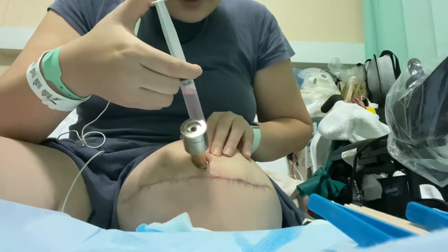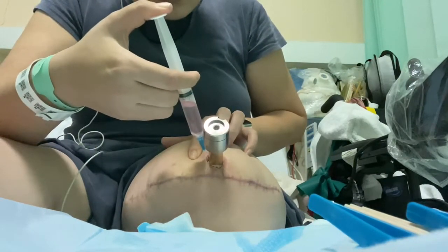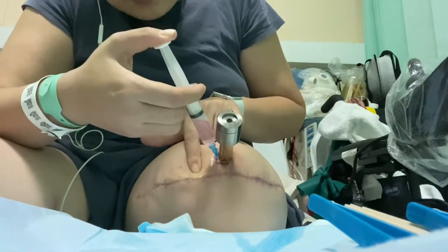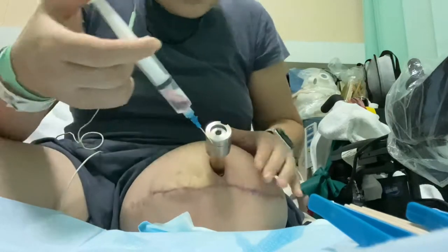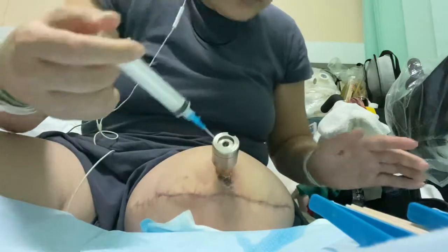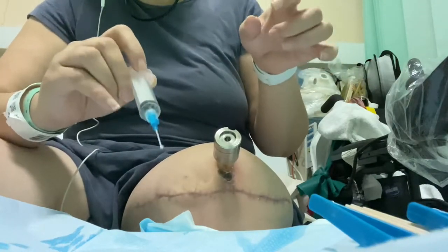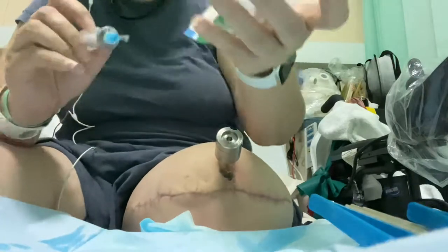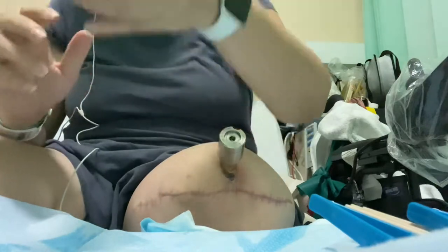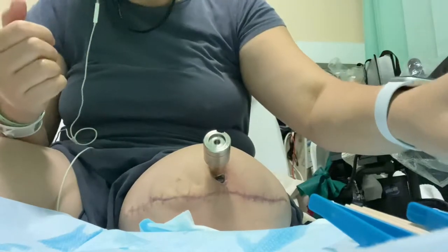Just gently use it. And then I can open a little bigger gap and this can use the syringe too. So I dispose this separately. Put it and pull it here. I clean my hands one more time, and it's time to do the applicator.